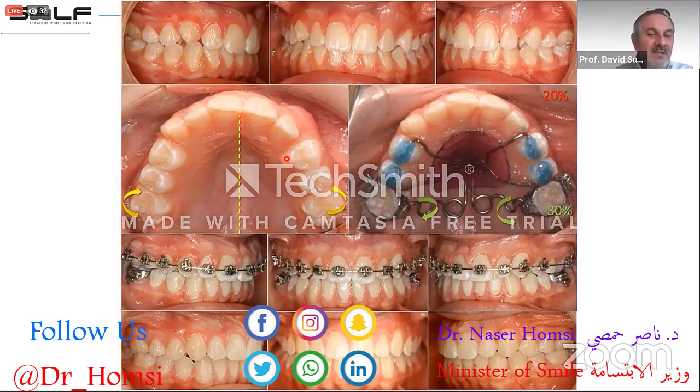What is the treatment? The treatment is not to put brackets on all the teeth in the mouth very fast with a coil spring. The first step is to put the first upper molar in the correct position. In this case, we are using a pendulum appliance to distalize this molar.